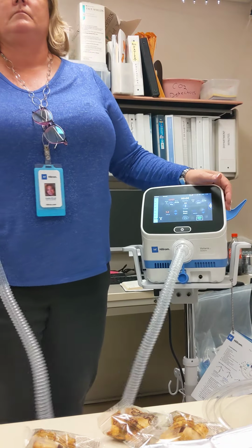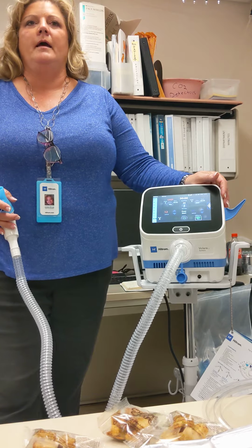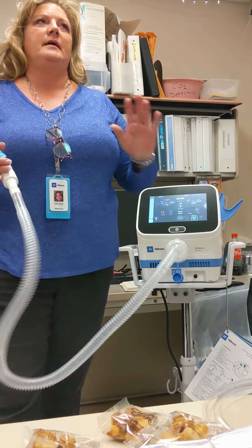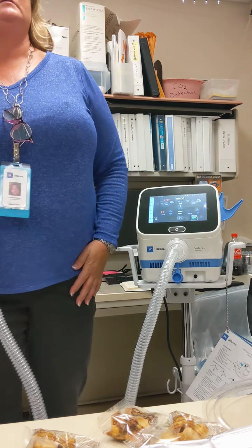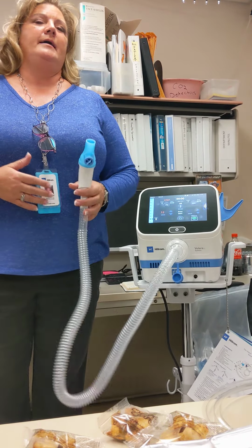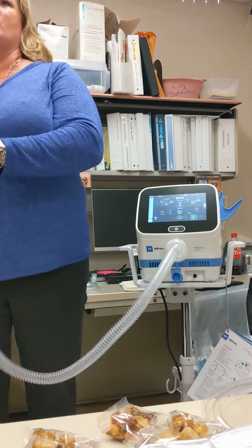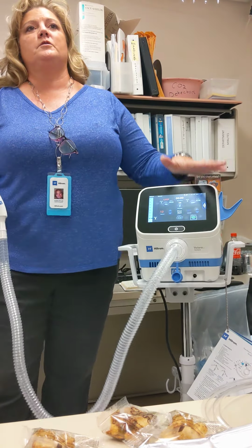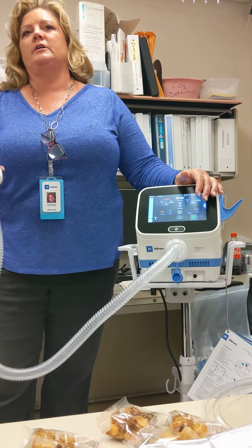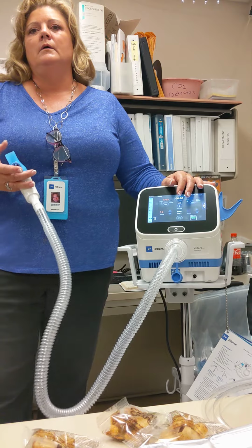Well, we also left it in volume, and that was the issue. That was the problem. So we're part of the leadership board, and asked to have that change in the manual. When you're on volume, you go off, because this is precise pressures. We're looking at pressures, and you're going to see it better with the patient.